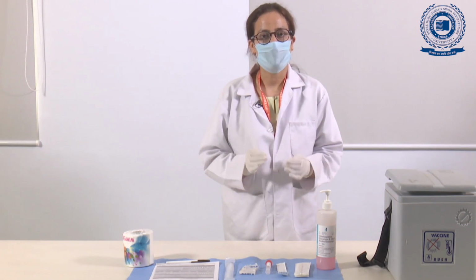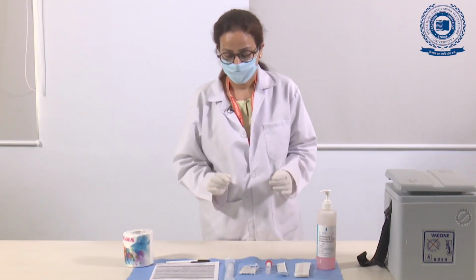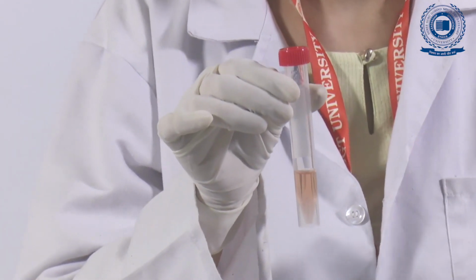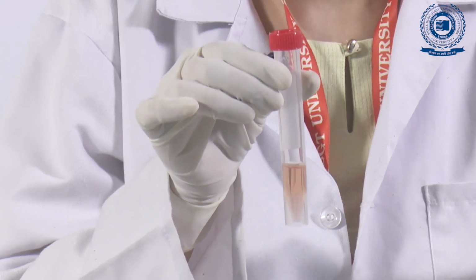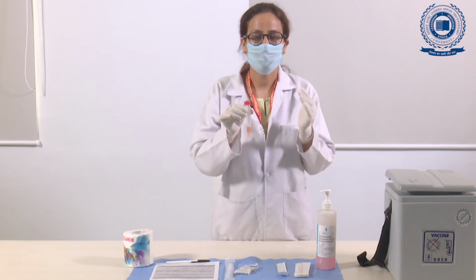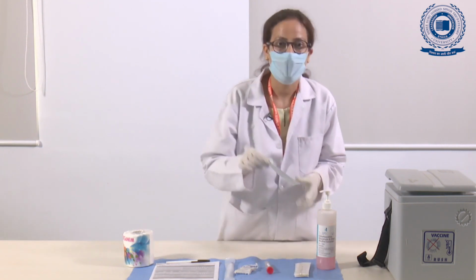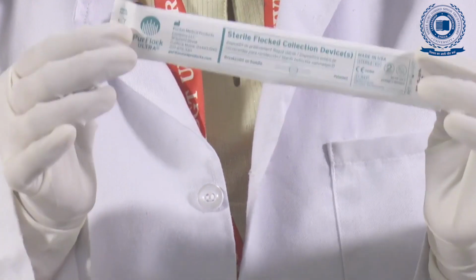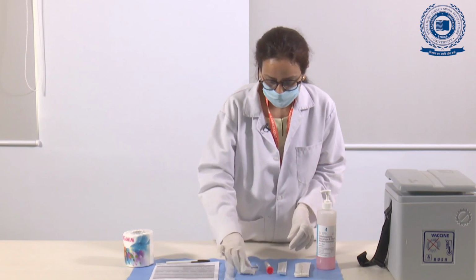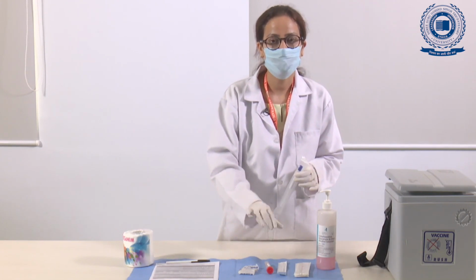For collection of sample for testing of COVID-19, I'm going to enumerate what the requirements are. First, we need a viral transport media which has an antibacterial agent, that is gentamicin, and an antifungal agent, which is amphotericin B, to inhibit the growth of any contaminants and allow the growth of only viruses. The second thing is the swab, that is a flocked swab, which we use to take the nasopharyngeal, nasal or throat swab. The third thing is a primary receptacle in which we are going to store the VTM with the sample.